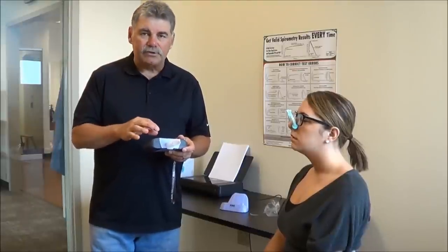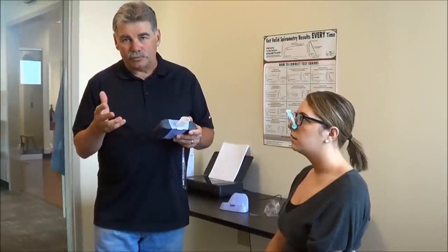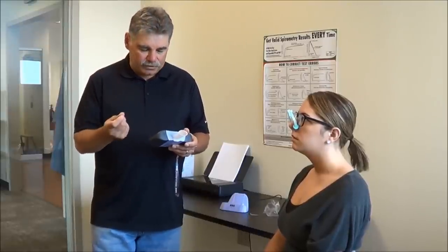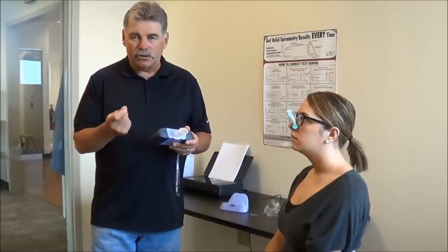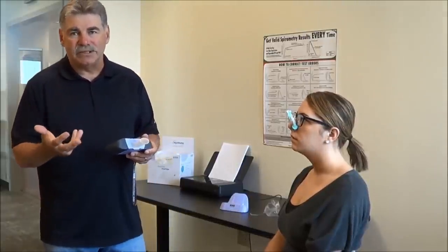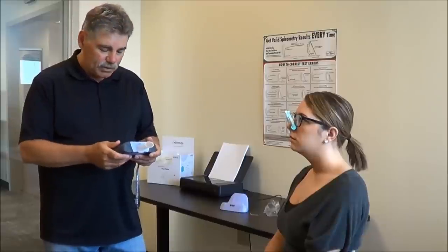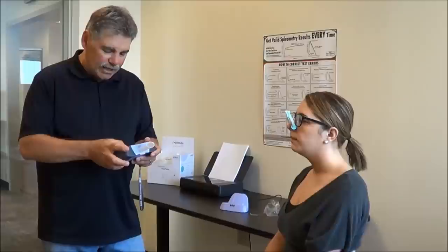So I got good effort due next, meaning that the second effort was acceptable, and I have a C grade right now, which is pretty good. We're on track. If I do another third good effort where the reproducibility is good, I hopefully will have an A or a B, which indicates that I've met the standards for a good spirometry test. So we're in good shape here. We've got two blows behind us. We've got one more to go. So I'm going to hit add trial.